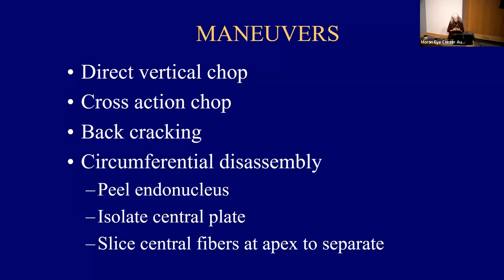So I want to stay within the safe zone at all times. So I've always been a vertical chopper. And one of the reasons that people have so much trouble with that is that as you go in, you've got to gain enough purchase and stay in foot position two in order to then dig in with your chopper and lift and separate. So the idea is that the sucked in phaco lifts a little bit while the chopper sort of depresses a little.